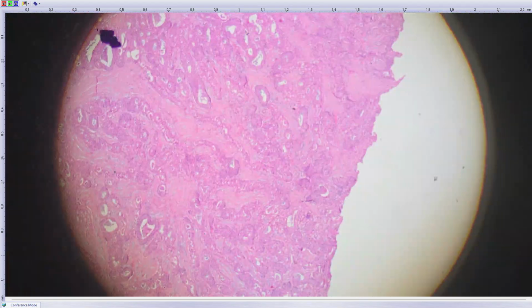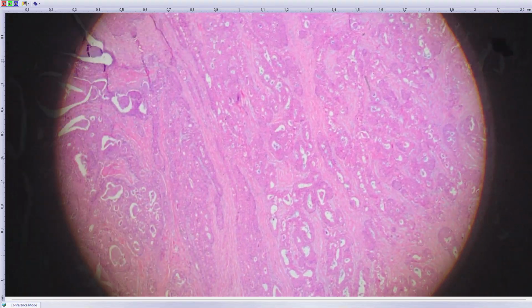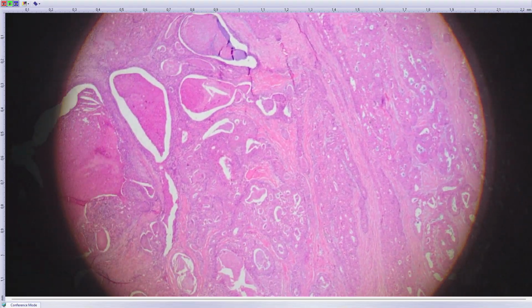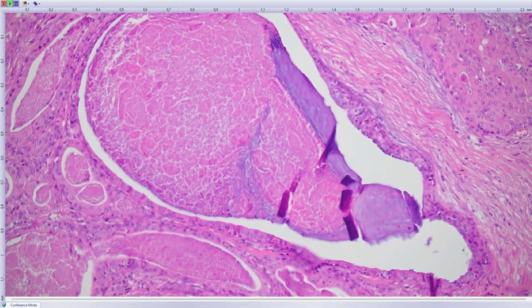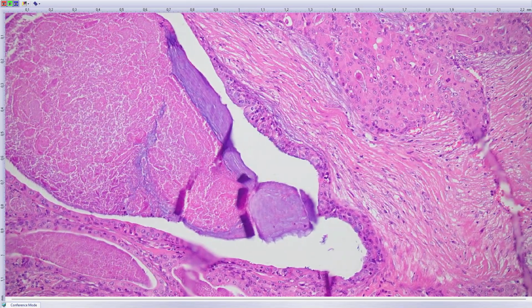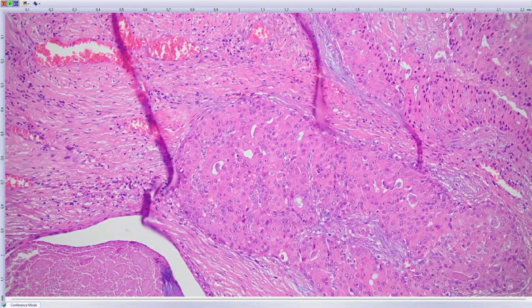I believe it's important to know that mucoepidermoid carcinoma may look like this oncocytic variant, with a little bit, maybe here I'll be able to show you some mucin production, but not really very extensive. So, mucoepidermoid carcinoma. That's all what I have. Now the podium is yours.